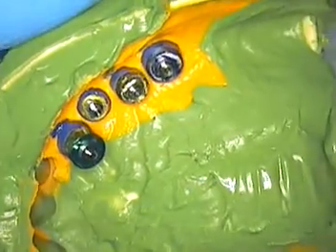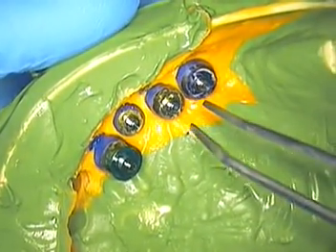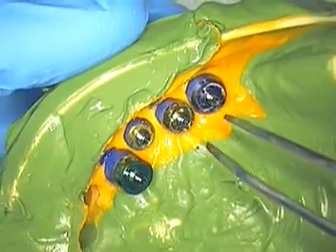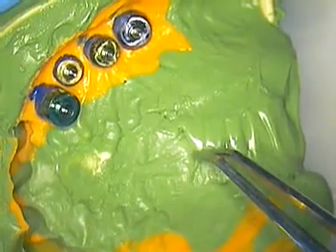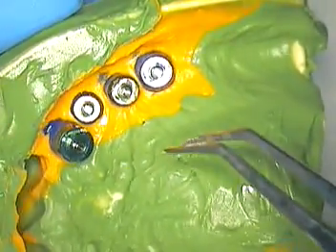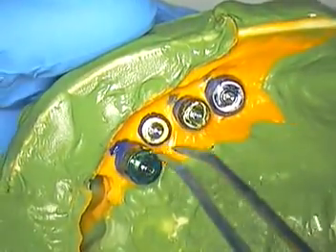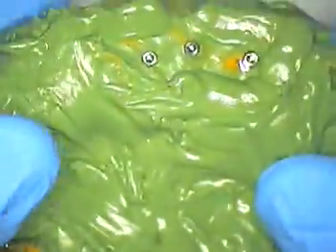One more thing I'll mention: there's a significant difference between an open tray impression coping that goes into the implant versus the other type — the closed tray — which has a long extension and a much longer insert into the implant. With the closed tray, you're more worried about the rebounding effect of the impression material, the coefficient of setting expansion, hardness changes that occur, and so many variables that come into play. You're dealing with threads that don't have much give — you're dealing with intimate fit. There's really no better method than this fixating — not only in the mouth — reversing it now to show you the open tray method.